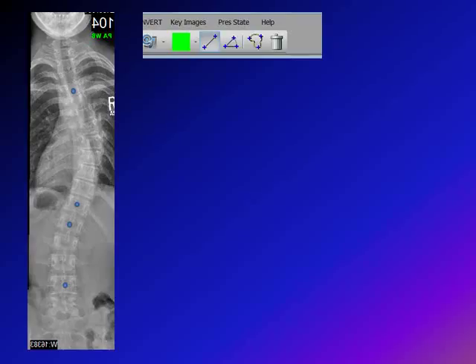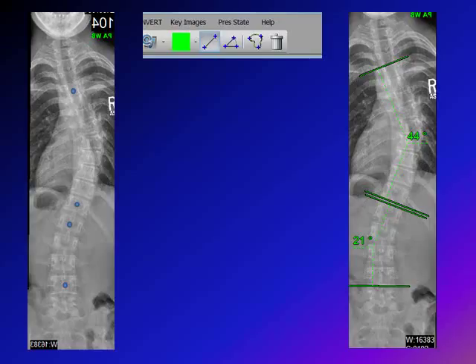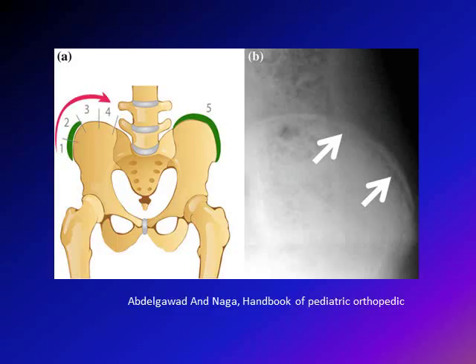It's a bit easier with electronic digital x-rays like the PACS system. The first step is the same — identify the most tilted vertebrae above and below for each curve. Then you click on the angle-measurement icon, which differs between systems but all systems have this ability. You draw the line for the superior end plate of the upper tilted vertebra and the inferior end plate of the lower tilted vertebra, and it immediately gives you the number — you don't have to draw perpendiculars yourself.